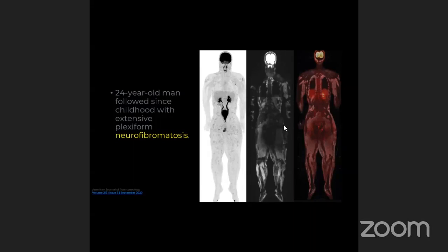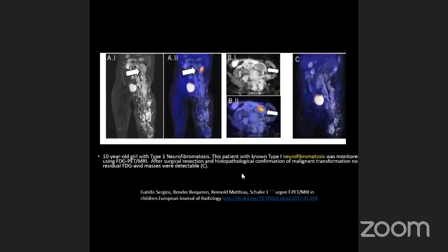So in this case, there is no avid uptake. There is some low-grade uptake along the lesions here, which is in keeping with the context of a benign neurofibromatosis. Let's see another patient.